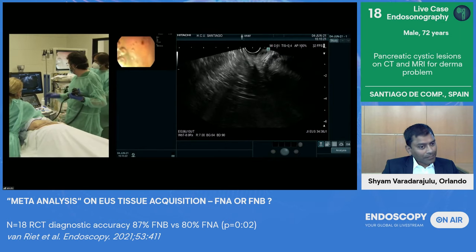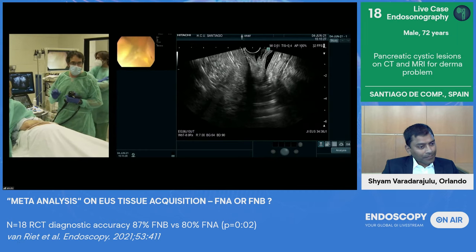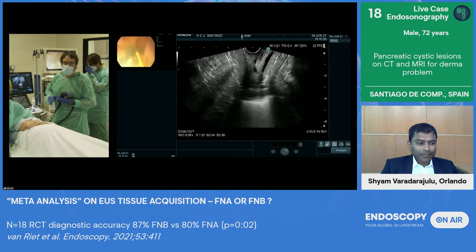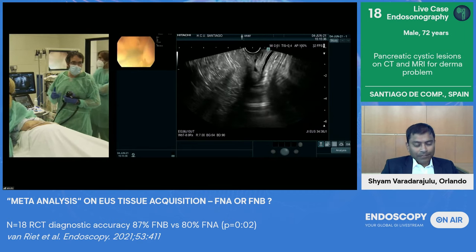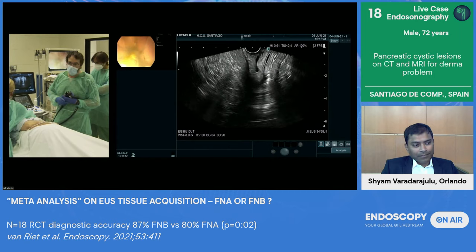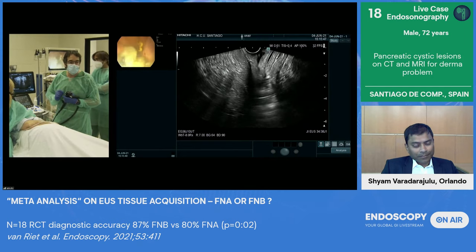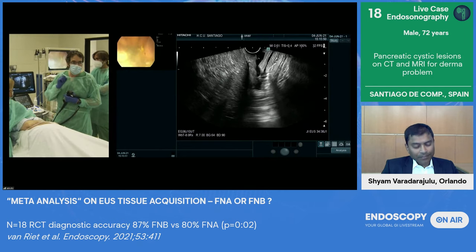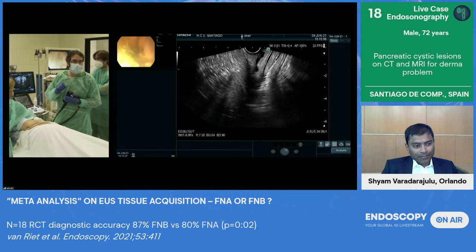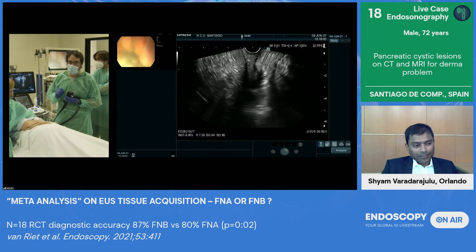Before going on, I'm just going to go quickly to the pancreatic head because one important message when you're evaluating a cystic pancreatic lesion, and this seems to be a mucinous lesion because there are multiple lesions, is that you need to see the complete pancreas, because we know there is an increased probability in these types of lesions to find solid lesions corresponding to a pancreatic adenocarcinoma. So my recommendation: EUS is the most sensitive method for the detection of small solid pancreatic lesions. Don't stop at looking at the big one, just try to see the complete pancreas. And this is a very important message of today. This is not only a therapeutic tool, it's probably one of the best diagnostic tools we have for pancreatic diseases. So please always complete the exploration.